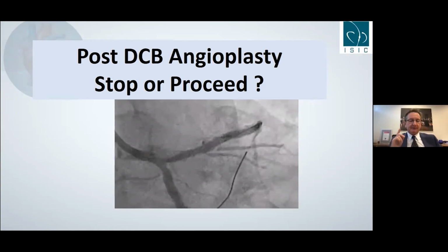Yeah, Goran, good point for discussion. Really good case. Congratulations to colleagues. I fully agree with Goran. The struts are partially protruding into the left main, but I'm surprised how good the circ ostium now looks. I was expecting not so good results. So from this point of view, you could go from the left, but definitely for the LAD and this distal constellation, you cannot leave it. You have to go forward.